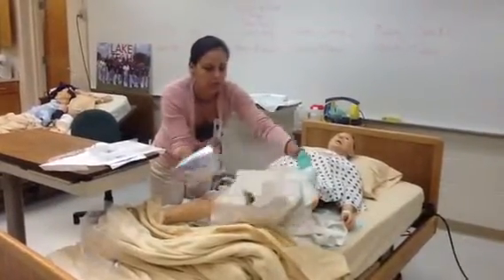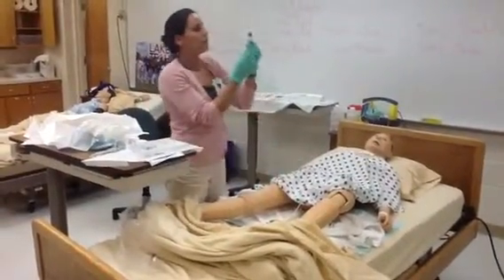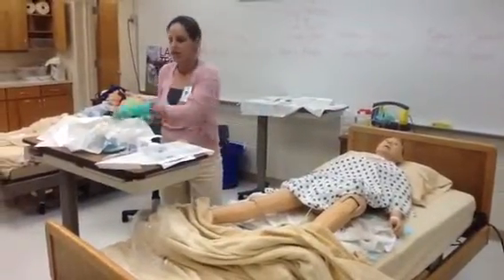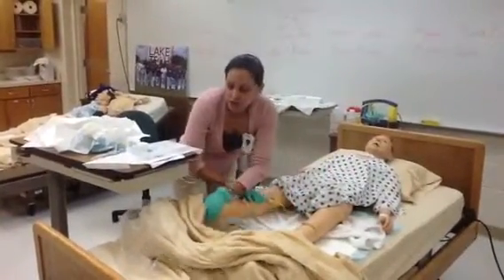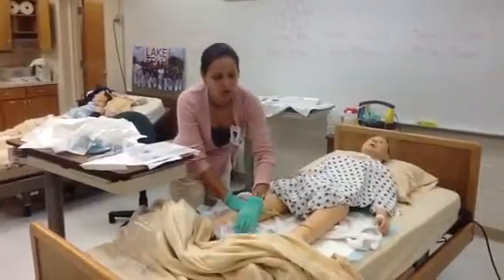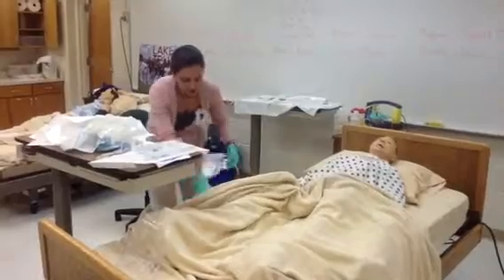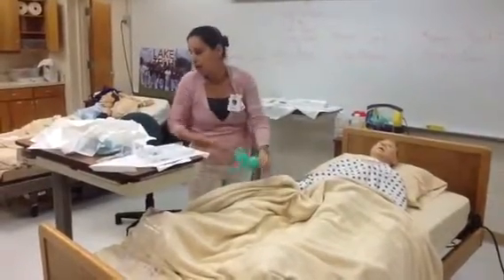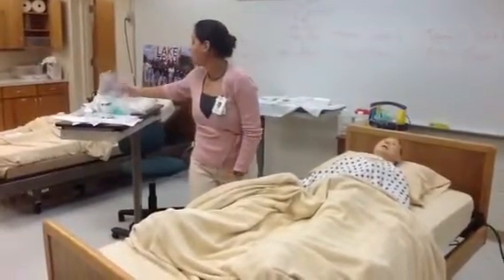The other thing that I'm going to note is the amount of fluid that I put inside of that balloon. And it looks to me that I have 2 cc's left, so 8 cc's are in my balloon, and that is something that I would document. And I would document which side I secured the catheter to, how my patient was able to tolerate this. And then I would secure my catheter bag below the level of the bladder to a non-moving part of the bed, okay? So I would choose something that didn't move like the frame of the bed.